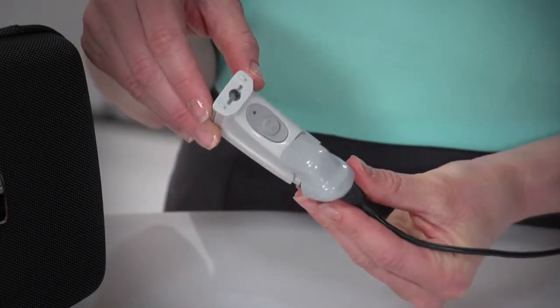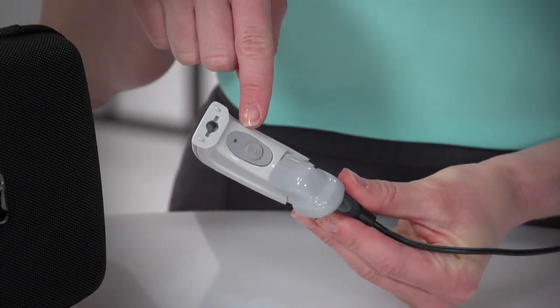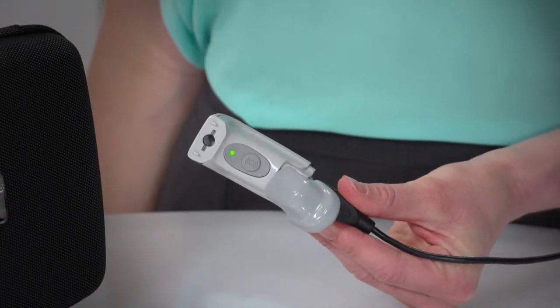When charging, the LED indicator will slowly flash orange, and when it reaches full charge, the LED indicator will be solid green.